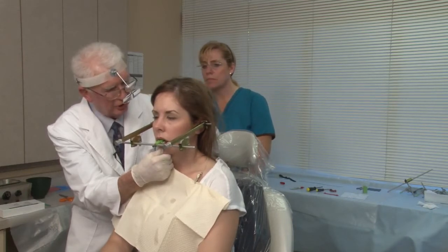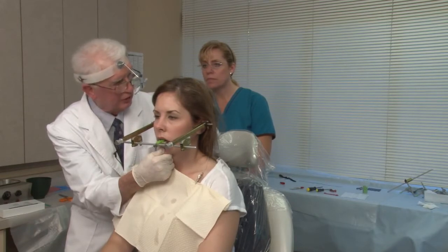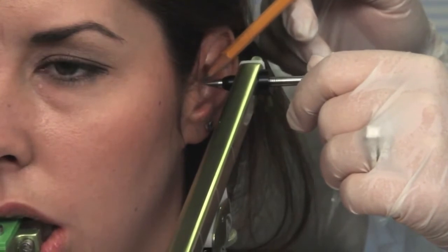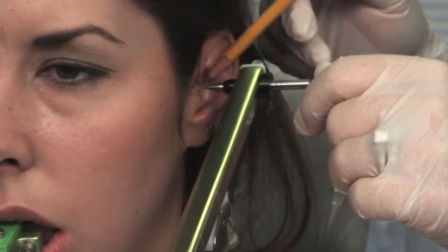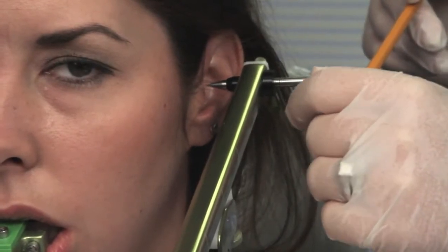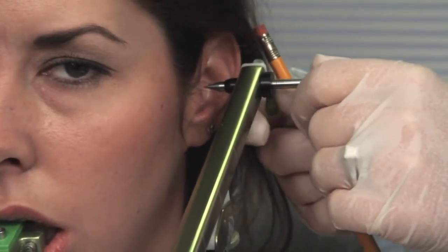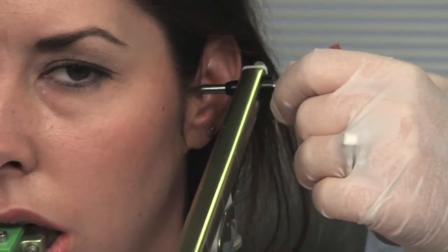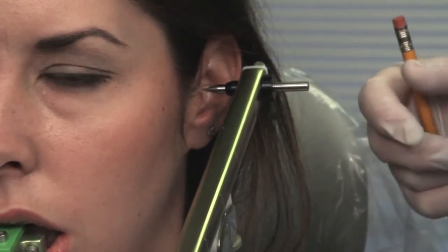Close, hold it. Do not move. Now then, Christy, you start marking. Now the graphite mark is very faint, but make sure you get one. Okay, move it in. You move it in, touch it, turn it a little bit, and pull back and see if you got a mark. Okay, pull it back. Okay, now we got a mark.